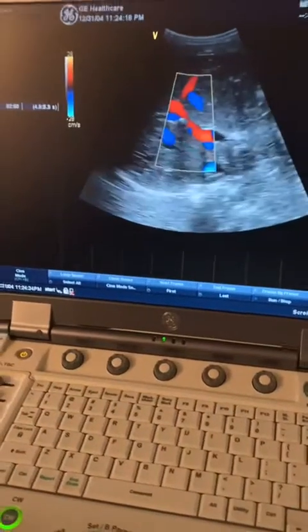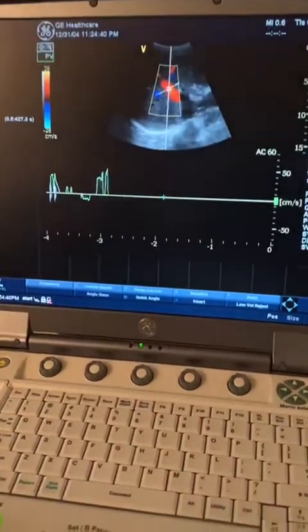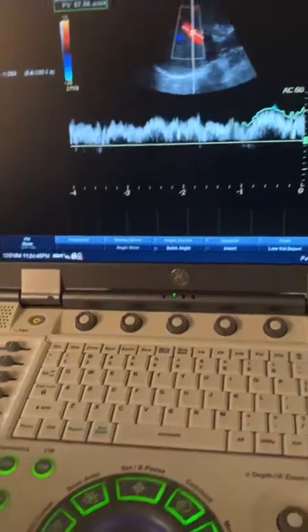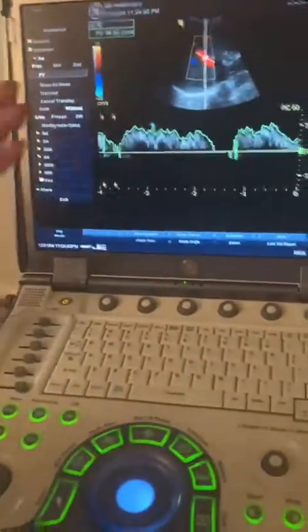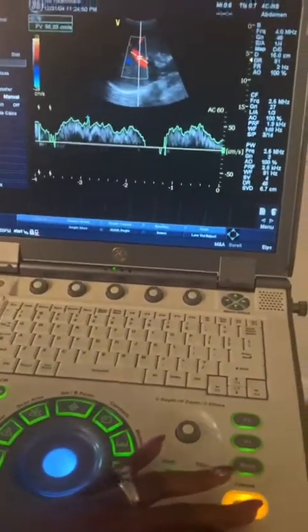Now I'm going to unfreeze and get a quick pulse wave doppler of the portal vein. I like to always use angle correction when scanning. You don't have to use a tracing, but I like to have an angle on so that I can try to get the highest possible velocity in that portal vein.